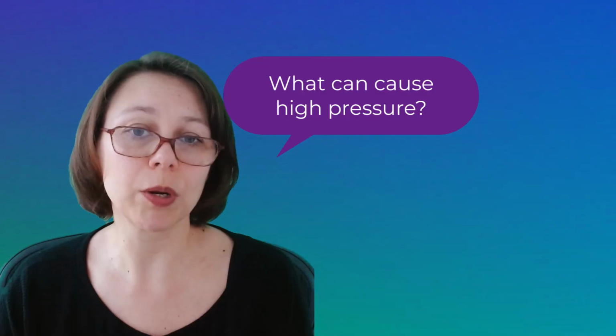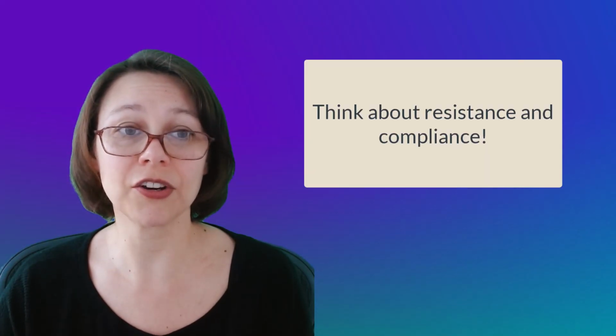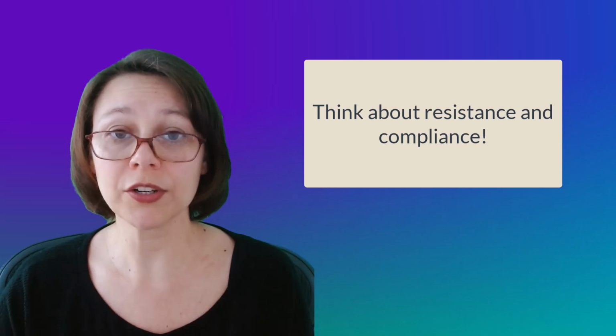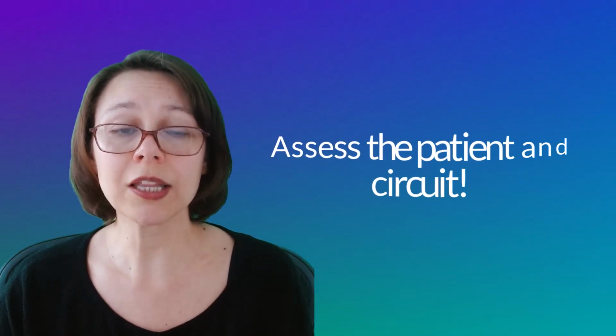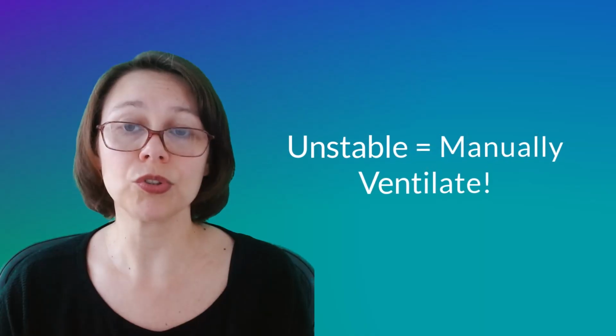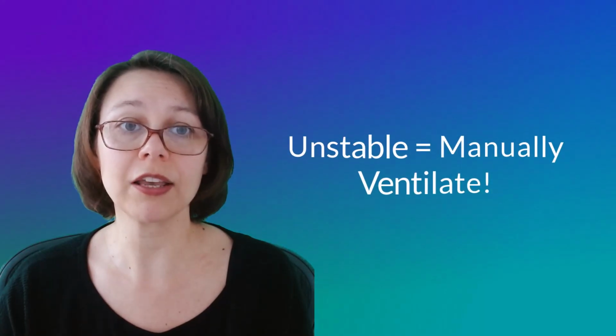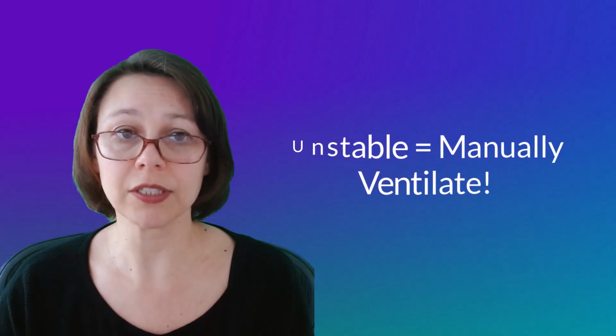So what can make inspiratory pressure high? It's anything that causes increased airway resistance or decreased compliance. That will cause pressure to increase. You want to quickly assess the patient and the circuit. If the patient's vitals are relatively stable, you can move on to troubleshooting. If they aren't stable, then you should always remove the patient from the ventilator and provide manual ventilation. This is true for any alarm that is sounding.